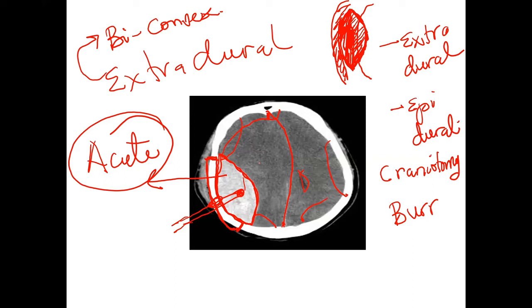So you don't concentrate only on bleeding. There are some other features you also look out for in a patient that presents with a brain CT scan.